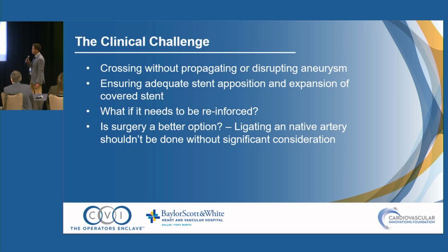We did discuss this with our surgical colleagues about a potential bypass of this. They were not keen on potentially ligating her artery or bypassing because of her body habitus, and she did not have great veins as well, so they were concerned about the long-term patency of that. So we decided to move forward with an endovascular approach.